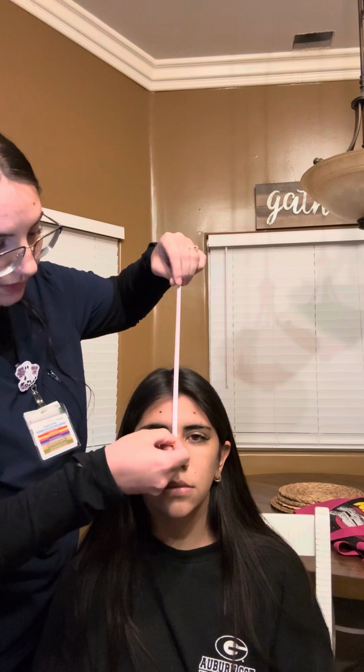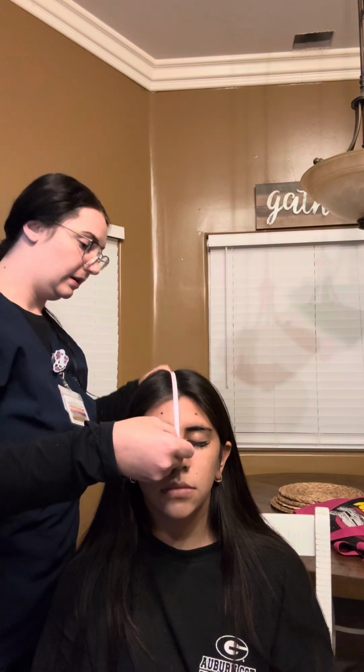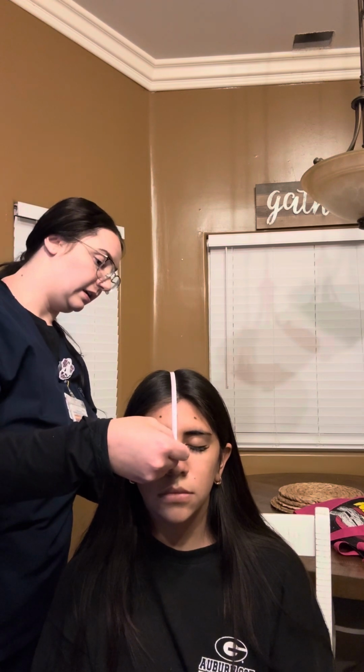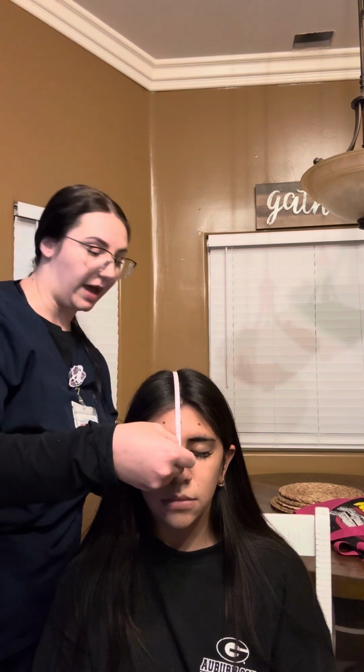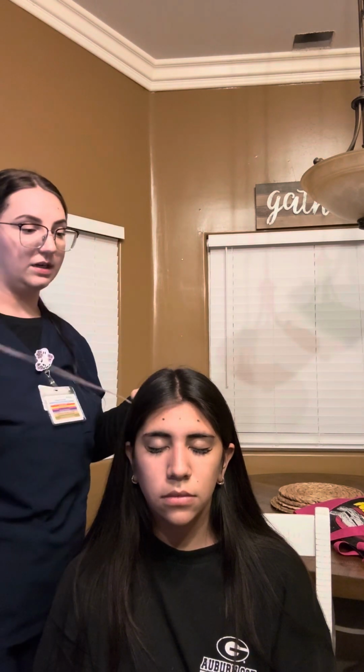For starters, I did the nasion to the inion, and we always use centimeters. Something else I forgot to mention is that everything odd is on your left side, and everything even is on your right side. I'm going to go from 0 at the nose straight back to the inion, the little bone you'll see in the back. For her, I got 35.5 centimeters.